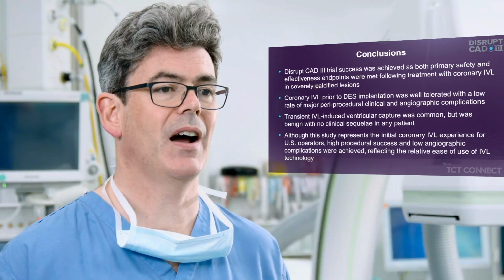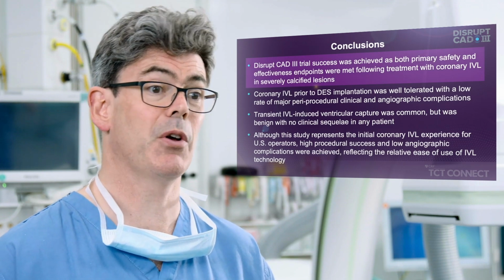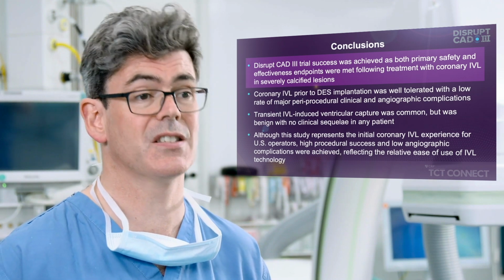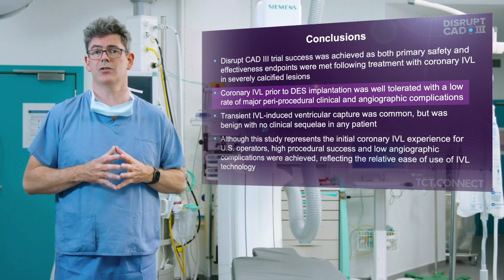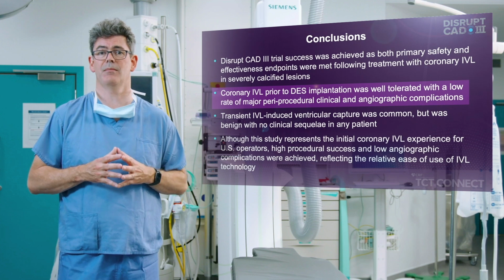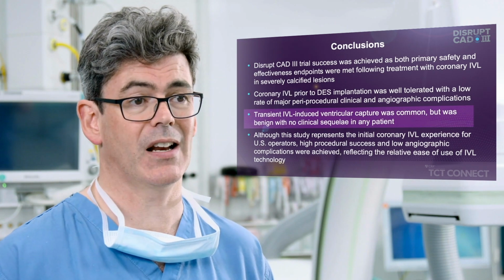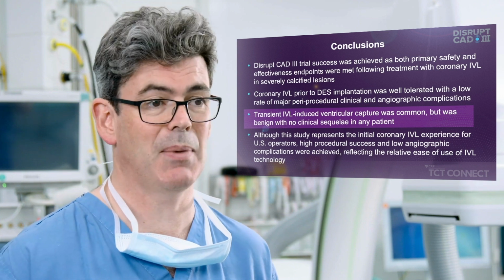In conclusion, I'd say that the success of the DISRUPT CAD III trial was achieved, as both the primary safety and effectiveness endpoints were met following treatment with coronary IVL in severely calcified lesions. Coronary IVL prior to drug-eluting stent implantation was well tolerated, with low rates of major periprocedural clinical and angiographic complications. Transient IVL-induced ventricular capture was common, but was benign, with no clinical sequelae in any patient.